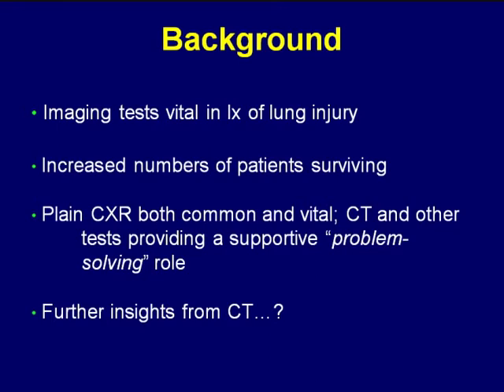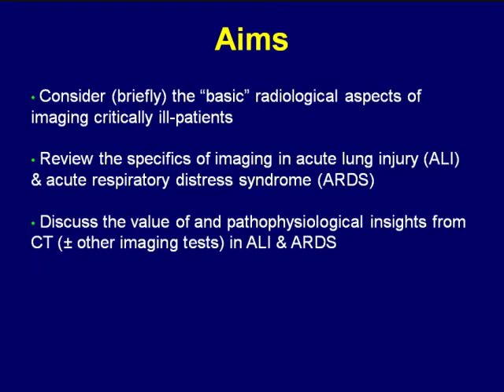The plain chest X-ray, as I think we will all understand, is a workhorse investigation. But CT and other tests, at least in the initial phases, simply provide a supportive role. But work and the literature tell us that there are considerable insights that we've gained from CT imaging, as I hope to show you in these next 20 minutes.